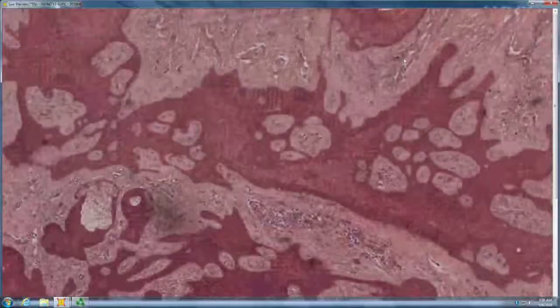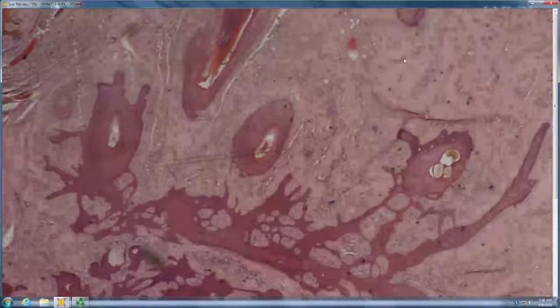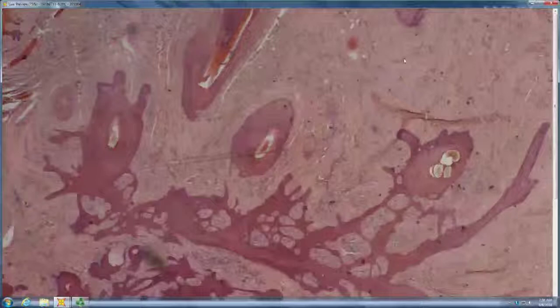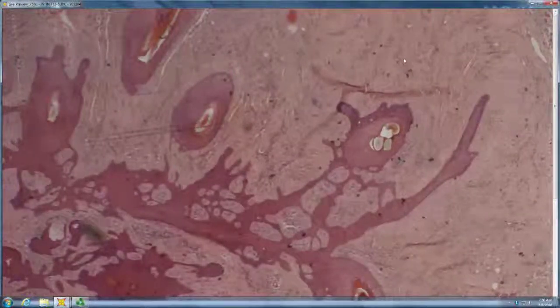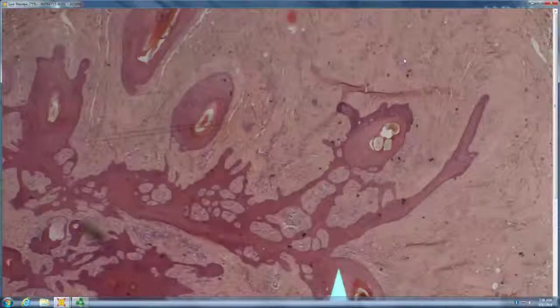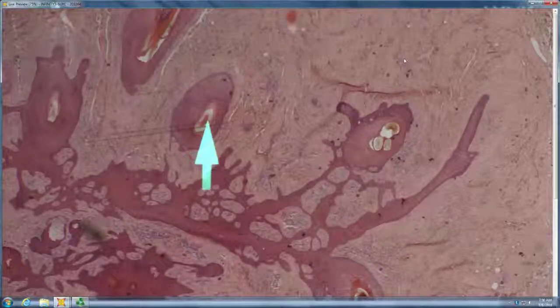Very good. Some have sebaceous glands and then blue strands showing pilomatrical differentiation, and kind of a fibrous orb. So fibrofolliculoma or the folliculosebaceous cystic hamartoma? Folliculosebaceous cystic hamartoma never makes hair fibers. Okay. Neither does a fibrofolliculoma. There's a hair.